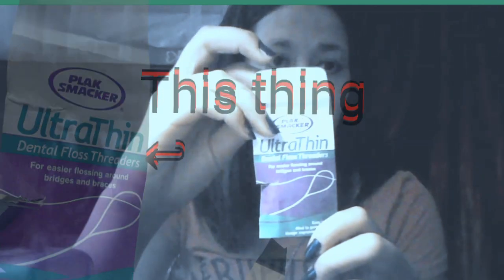Hey guys, I'm Chloe and today I'm going to be showing you how to floss with braces on. What you do is take out one of your floss threaders — they come in a pack like this, and they're little and green and they kind of look like a sewing needle.